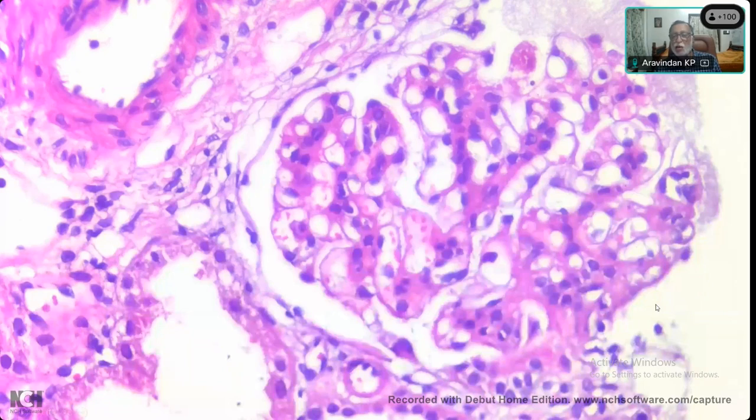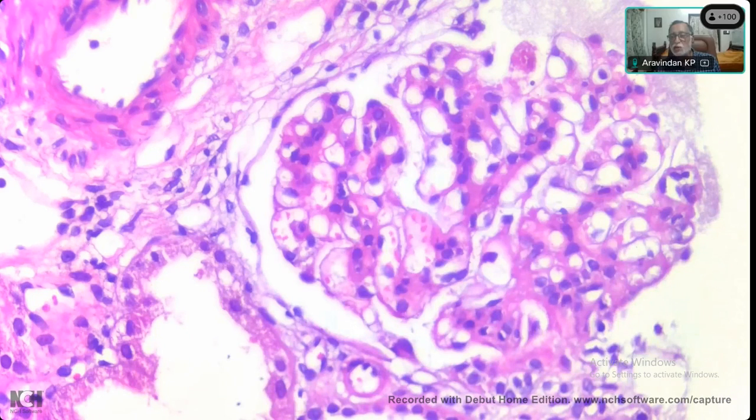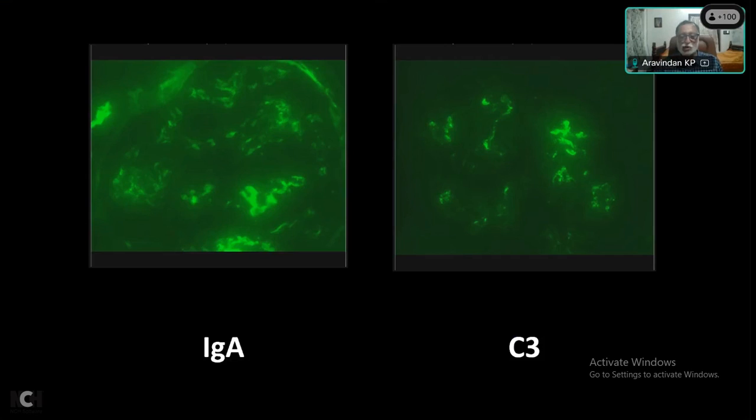And at this stage, what is absolutely necessary to make further diagnosis? Immunofluorescence. So this is the immunofluorescence picture. And how would you describe these deposits? So immunofluorescence shows mesangial positivity. This is mesangial fluorescence, not capillary, as we saw in the earlier case. These are all in the mesangium. C3, heavy C3 deposition. You would call this C3 plus, deposition of both IgA and C3. Okay.